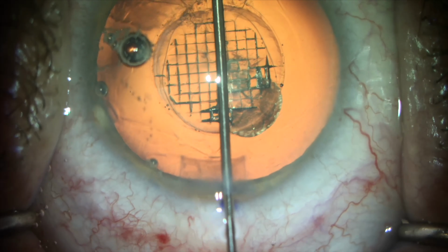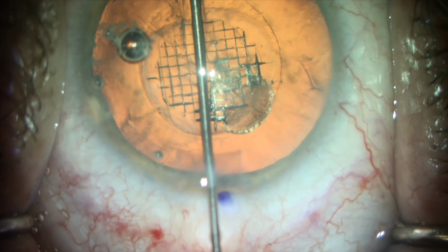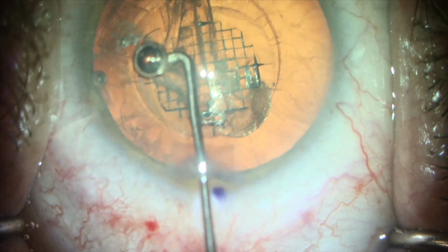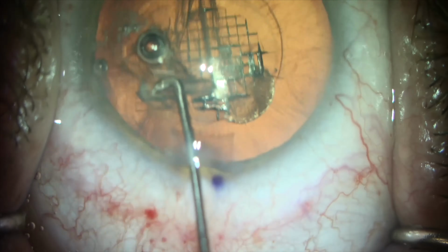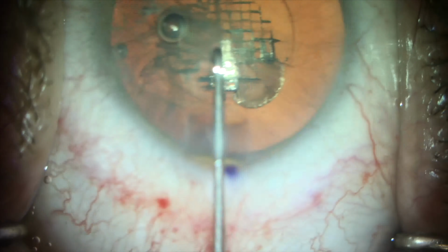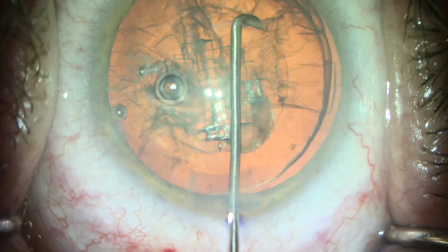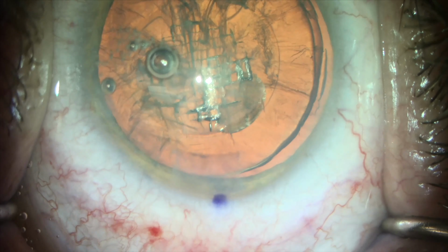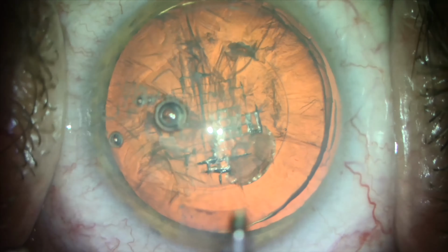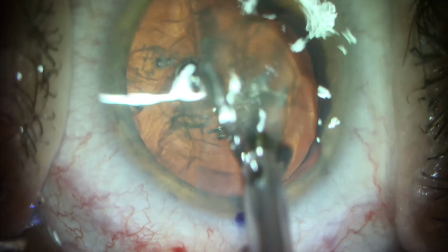We're about 50 seconds into the procedure and everything is routine, but watch what happens at the 59-second mark. There's a sudden, unusual response to the patient's hydrodissection. I know something is different, but I can't visualize exactly what is different. So we gently rotate the nucleus, and it rotates just a little bit, and that looks about right. And we're going to center up the microscope and introduce the phaco handpiece.